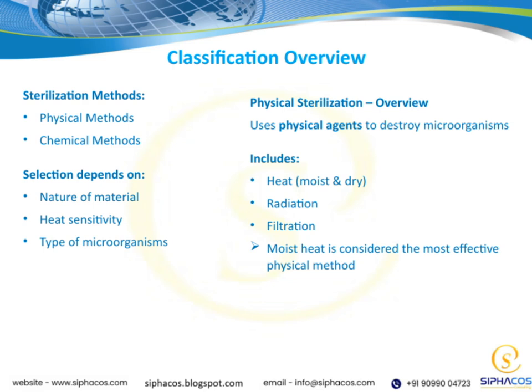Heat sensitivity is another key consideration, because some items might be damaged or compromised if exposed to high temperatures. And finally, the type of microorganisms you're targeting also influences the choice of method, as some microbes are more resistant than others. Understanding these factors helps us select the most appropriate and effective sterilization technique for any given situation.